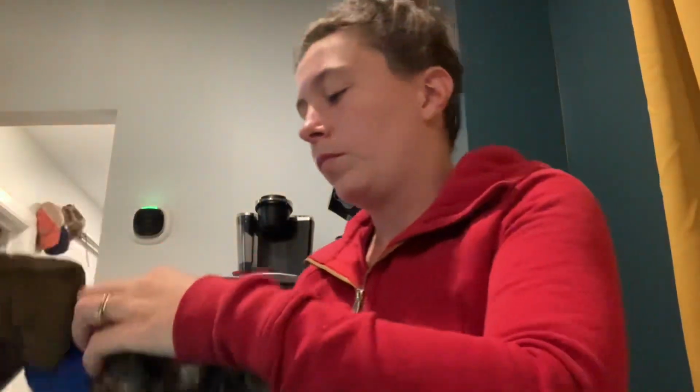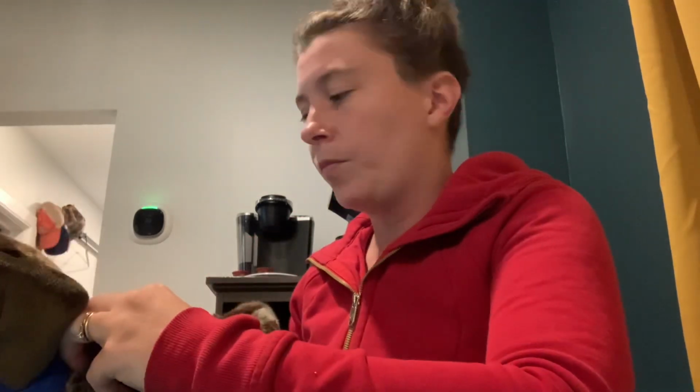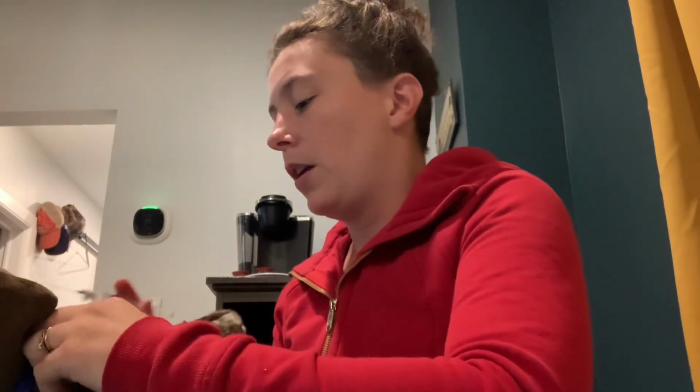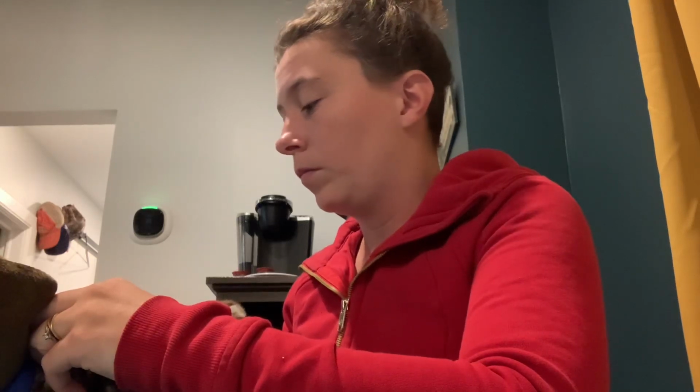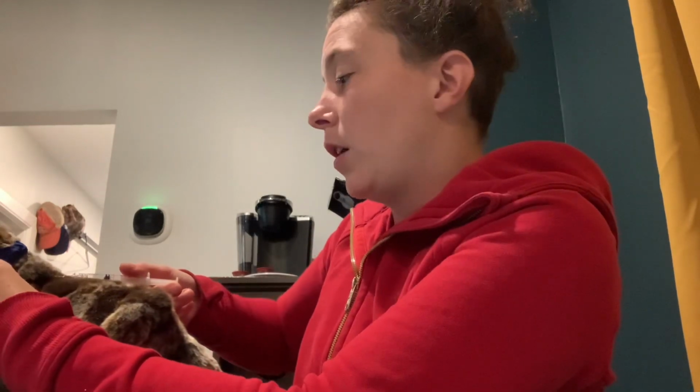Lastly, I'm doing a sub-Q injection. Sub-Q injection in dogs is most commonly done between the scapula here. It's going to be on the dorsal part of the scapula here. We want to make sure that we're building a tent. So we pinch the skin a little bit together here, building a tent. So I've got my tent. Okay, I can advance into my tent. I don't know how well you can see this, but I'm advancing into my tent there.